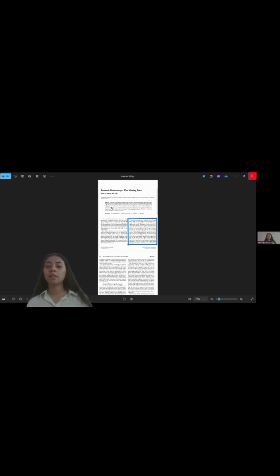It's a clinical method used to check how well the eye focuses or accommodates on a near object. So, how to neutralize the reflex properly during near focusing, and provide normative data that clinics can compare with patients.